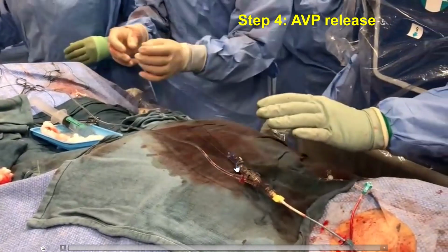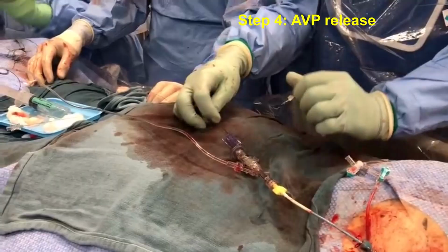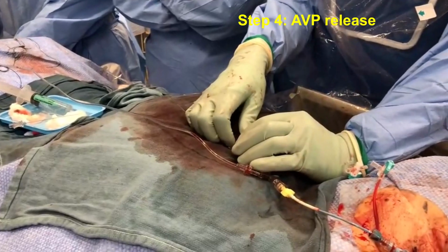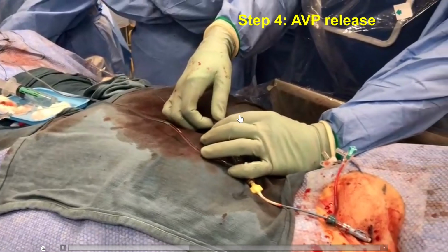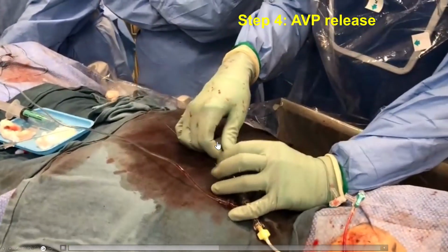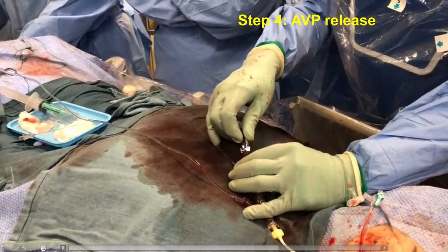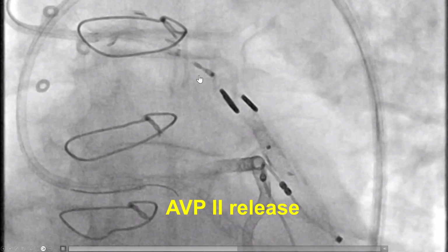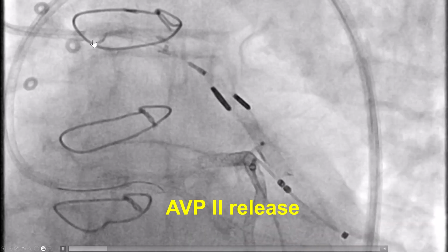We deploy by turning counterclockwise using the included torquer, and we watch it under fluoroscopy. So we're turning counterclockwise, and then we watch it. And then once we see that the connecting rod is separated, then we pull the shaft back. And this is how it looks. We're turning counterclockwise, and now it's disconnected, it's released, so we can pull it back out from the body.